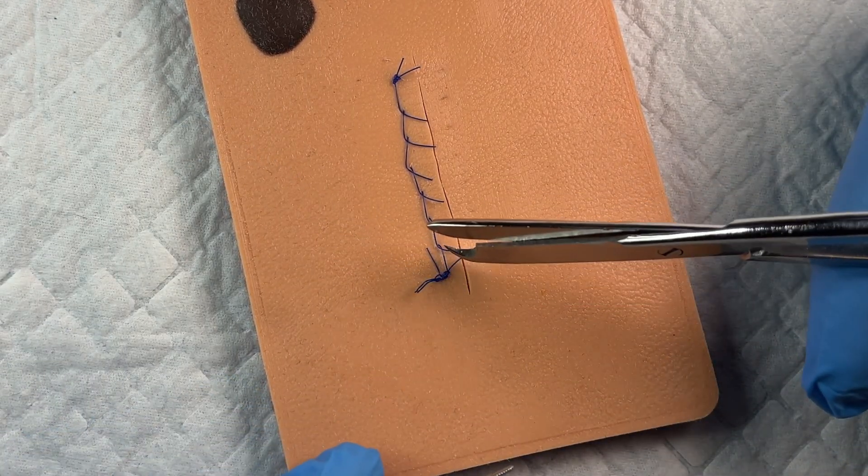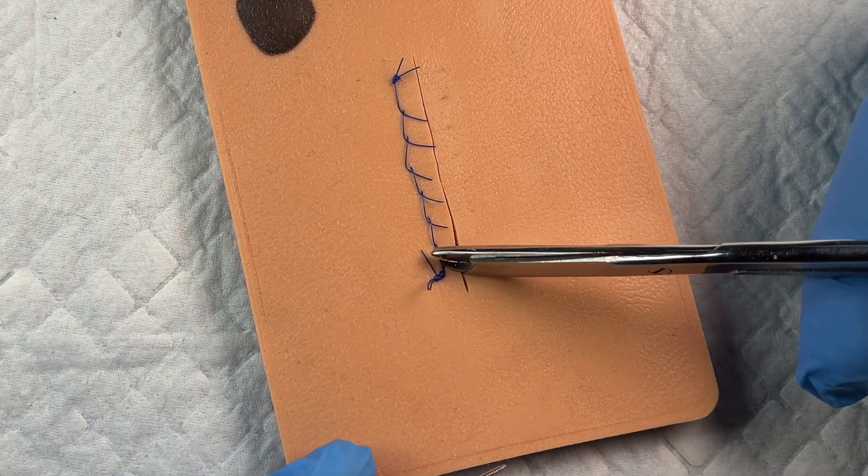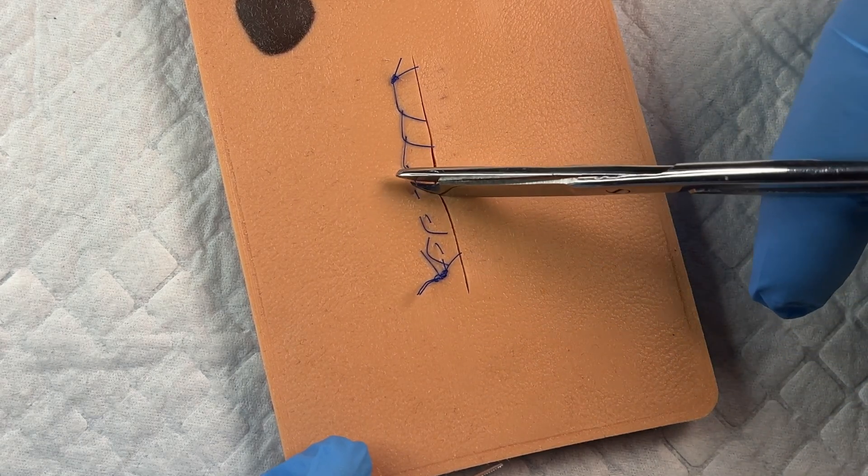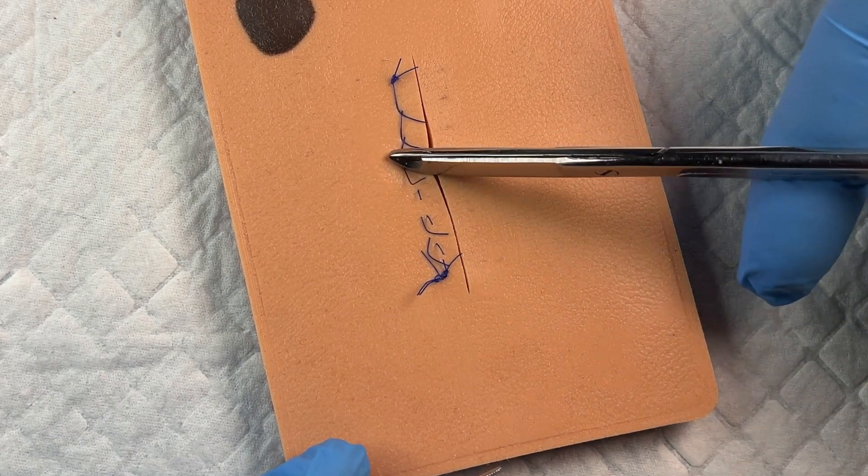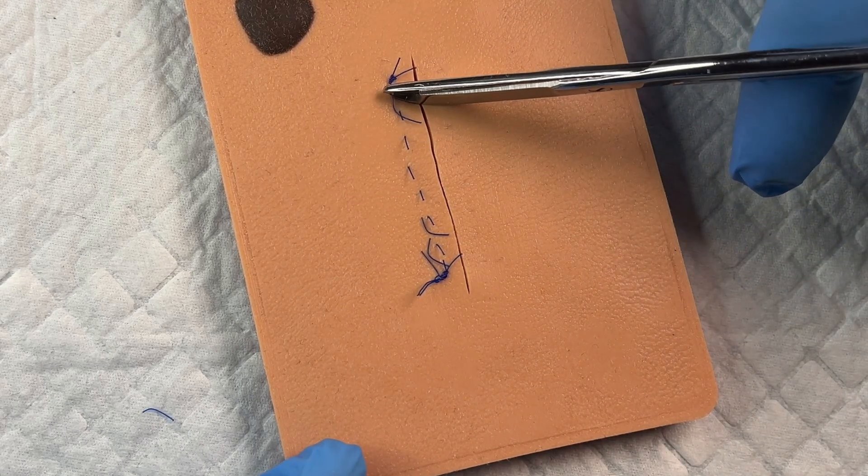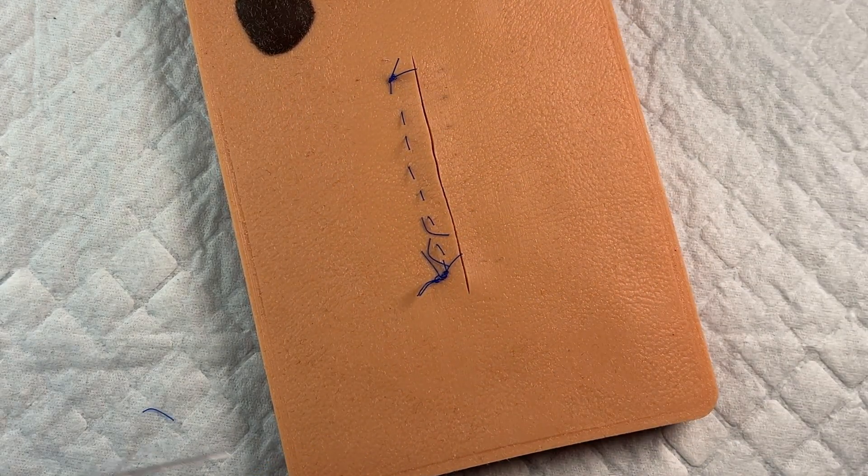And then before you do any pulling, cut right in the middle of these all the way up as well. So we're going to remove this more like a simple interrupted. So we're basically turning this running locking into a simple interrupted.